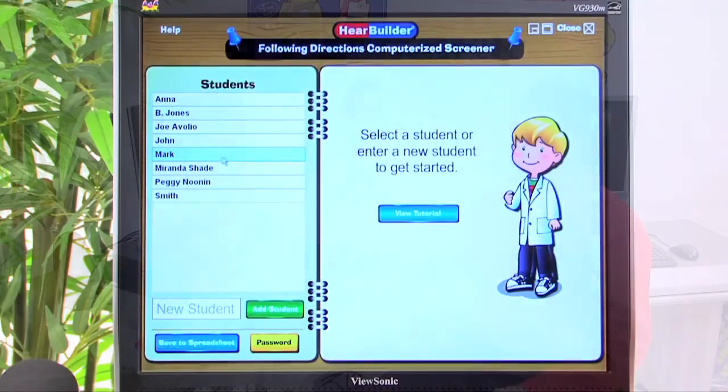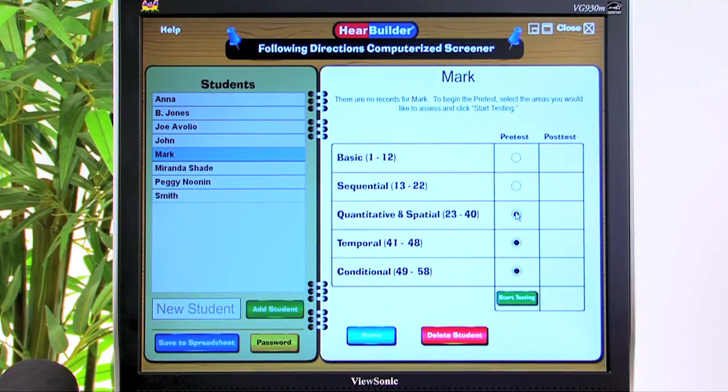We can go back to the home screen, and now let's take a look at a few examples from the Conditional Directions subtest.